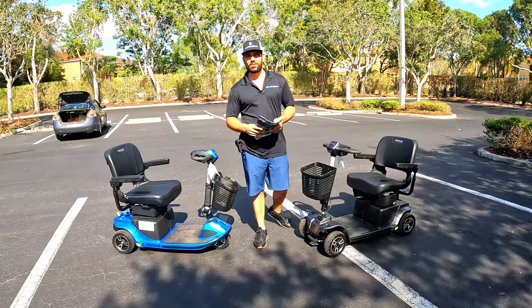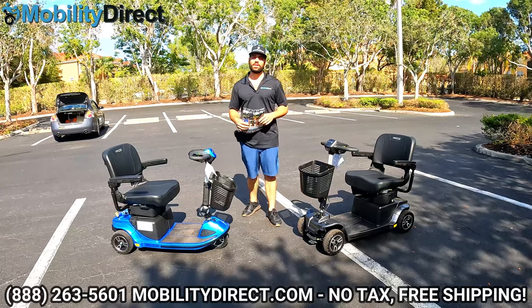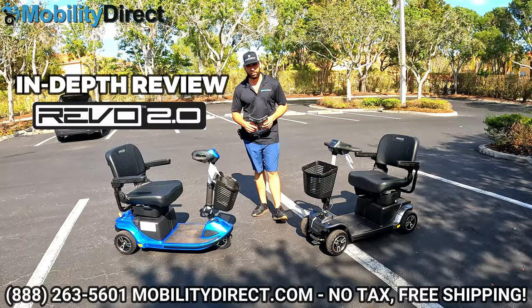Hi everybody, I'm Sergio with Mobility Direct and welcome to our YouTube channel. Thanks for stopping by. In today's video, we're going to give you an in-depth review of the Revo 2.0 by Pride Mobility.